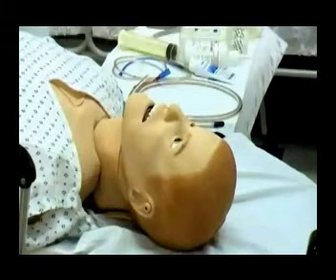And ready, meet Stan, our friendly simulation patient. Stan is presenting to the ER after taking a large dose of Rapamil in a self-harm attempt.